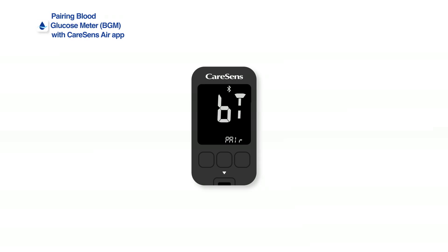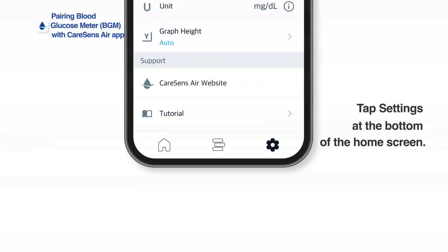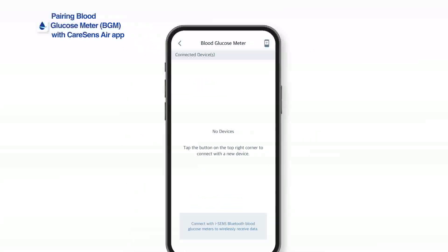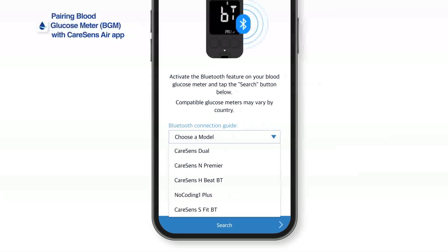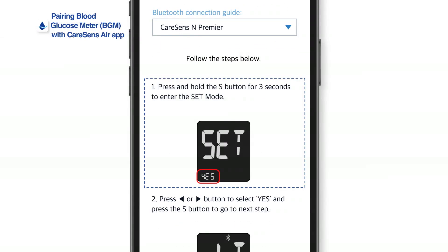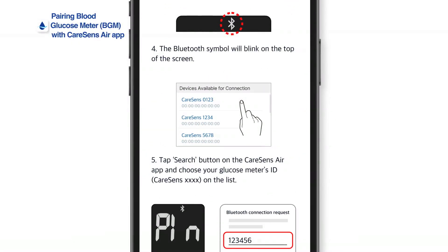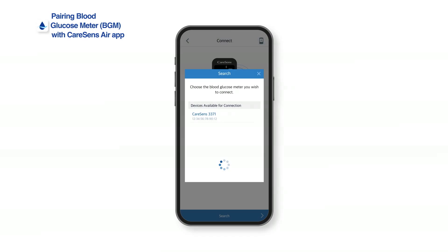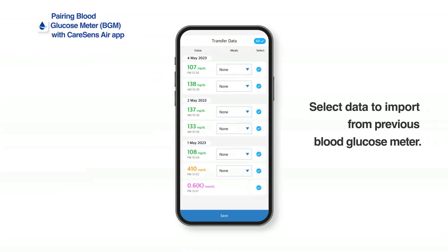iSense BGMs with Bluetooth function can be linked to the Kerasens Air app to automatically send glucose measurements. Tap Settings at the bottom of the home screen, then tap Blood Glucose Meter. Tap the blood glucose meter icon at the top right corner of the screen to connect with a new glucose meter. Tap the blood glucose meter you wish to pair with in the list of connectable devices. Enter the pin code shown in the glucose meter display. Once pairing is complete, data from your previous blood glucose meter can be imported. Choose the data you wish to import and tap Save.